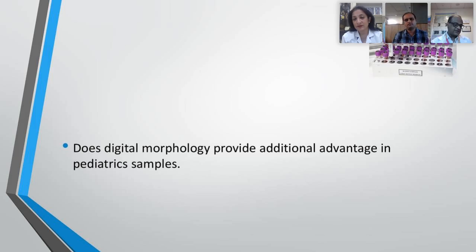It also says that CellaVision has a time-saving scanning of WBC for the diagnosis of lymphoblasts, and it can also pick up storage diseases if you have a bone marrow. It says that the pediatric population had excellent positive predictive value and sensitivity for blast cell identification in bone marrow rather than in peripheral cells. I'm reading it from this paper itself so that people can go back, freely download this paper, and apply it in their practices.